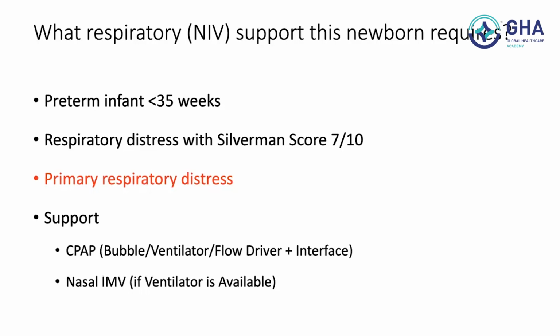CPAP can be given with bubble, ventilator, or flow driver, and with different interfaces. So we have different methods of giving CPAP: bubble CPAP, ventilator CPAP, or a flow driver CPAP. And the interfaces also could be different, like a mask CPAP, Hudson prong CPAP, Argyle prong CPAP, or a RAM cannula CPAP. So let's look at this.